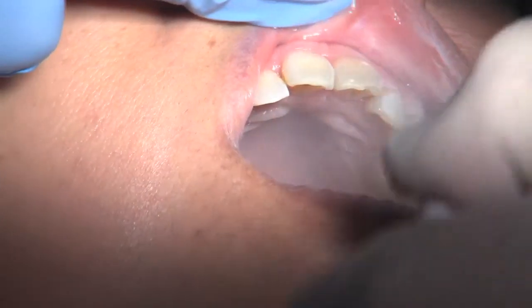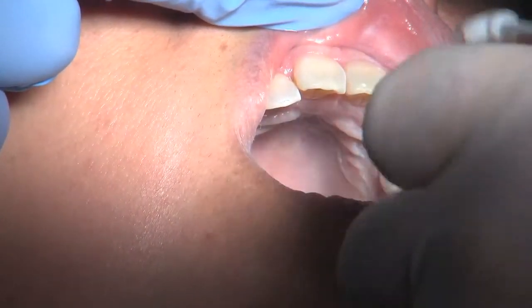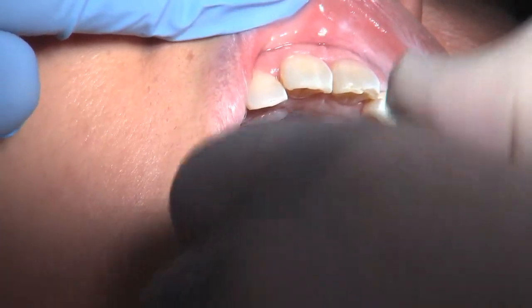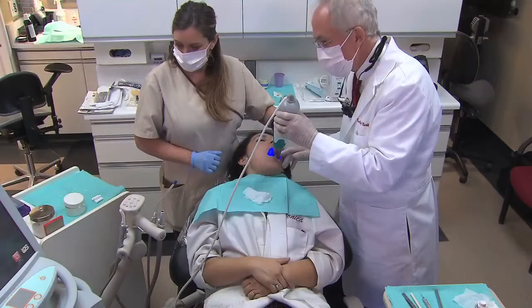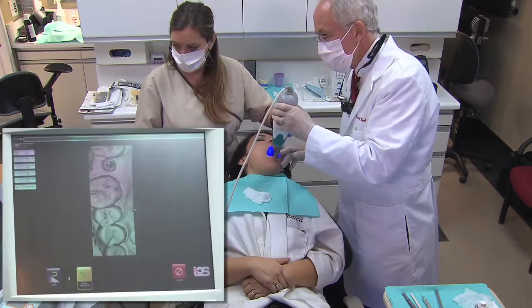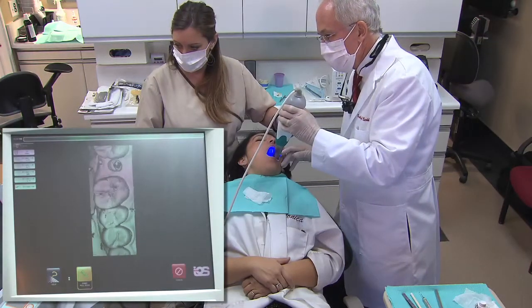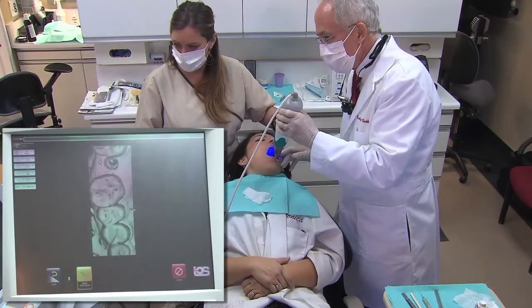The first step in the FastScan process is to spray a thin layer of the FastCoat material onto the adjacent teeth, the gingiva, and the implant. The first scan is of an occlusal view. The scanner gives constant feedback, and once you have the correct alignment, you simply press the foot pedal to capture the image.